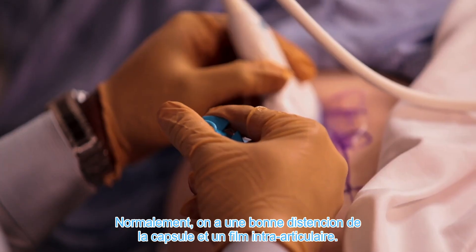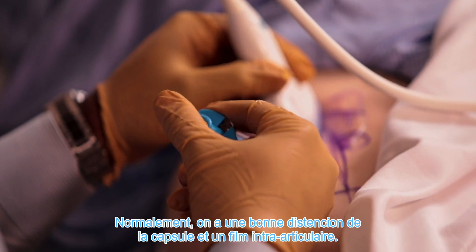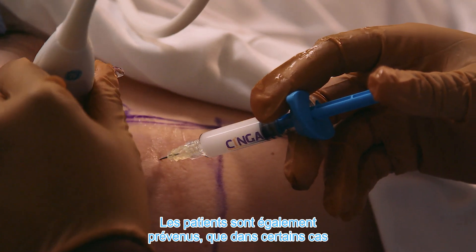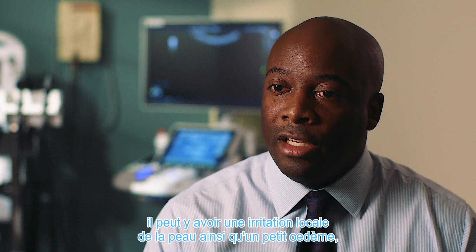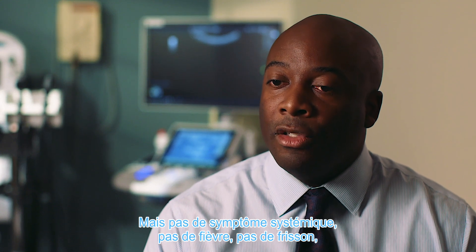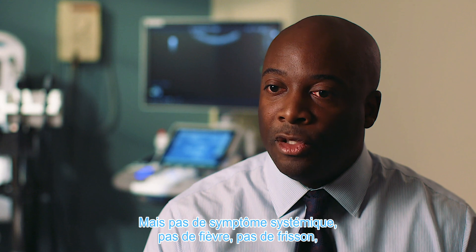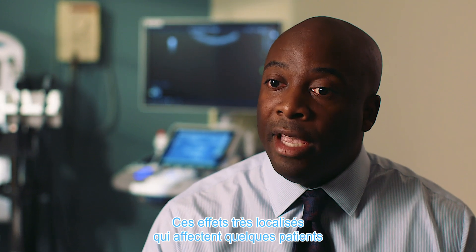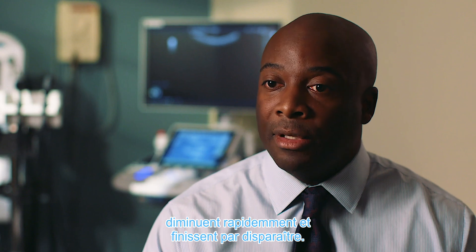Typically you get a good distension of the capsule and intra-articular fill. Patients are also told that in certain cases you may expect some local skin irritation, such as mild redness or swelling, but no systemic symptoms — no fevers, no chills, no rigors — which is important. That small area of redness can be anticipated in some patients but subsides without incident.